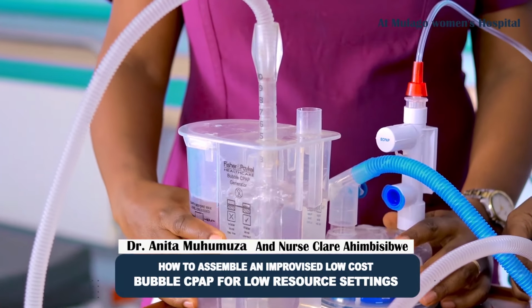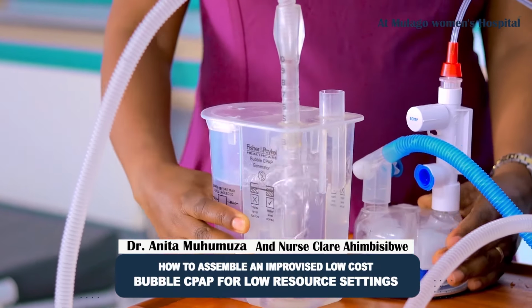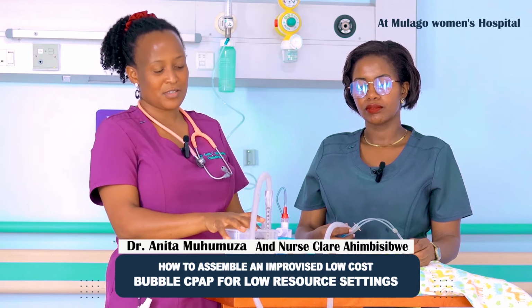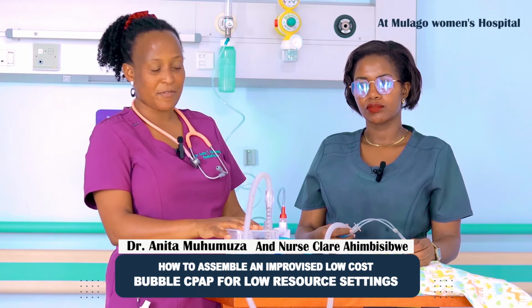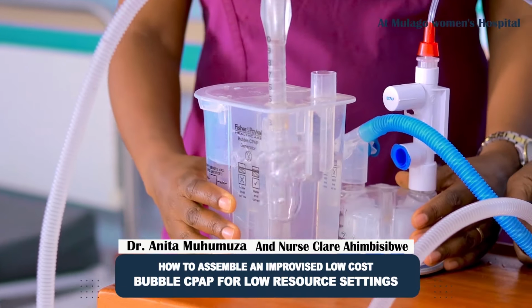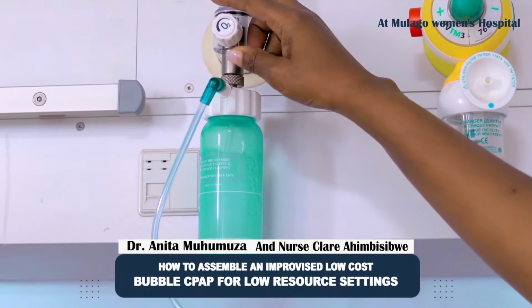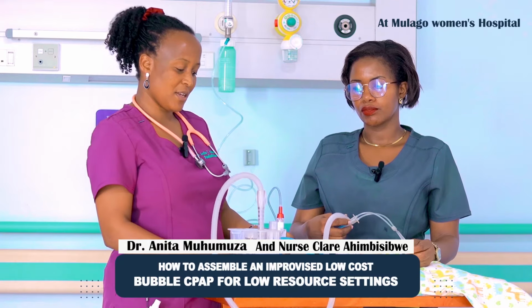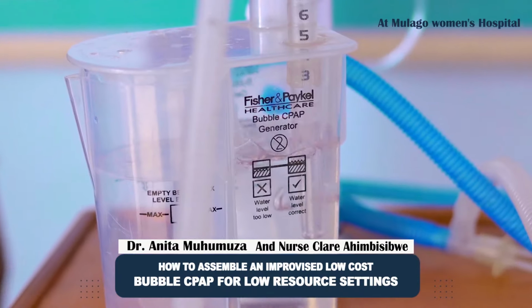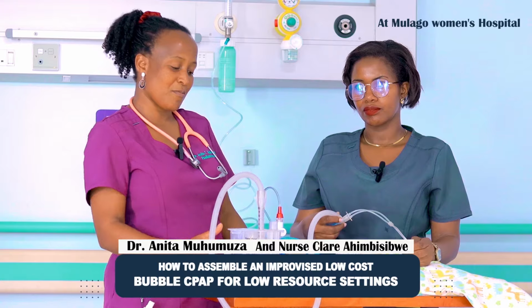So what we looked at was an improvised bubble CPAP for very low resource settings. However, we have this bubble CPAP kit, which is affordable and can actually be used in most of our facilities if we can procure some. You see it has this bubble CPAP generator, a humidifier bottle, and it also connects the oxygen source and the same nasal prongs to the baby. This is a simple CPAP circuit, and it can also be provided with a heater, which can give the baby warm, humidified air to prevent some of the complications.